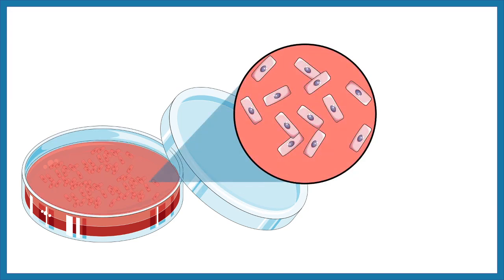Now, these cell suspensions are plated onto specific media which would support the growth of these cells, and that becomes our primary tissue culture. That means from the organ, you isolate the cell and plate it on a culture setting, and that gives you the primary cell culture.